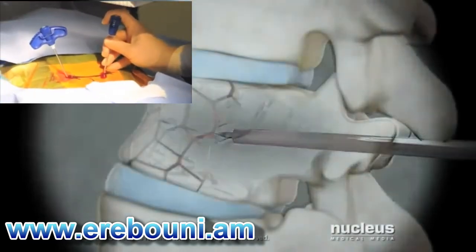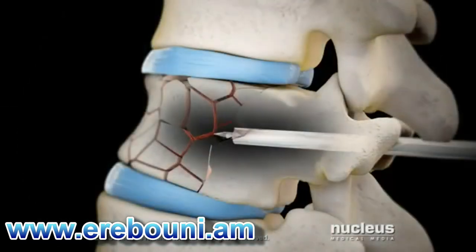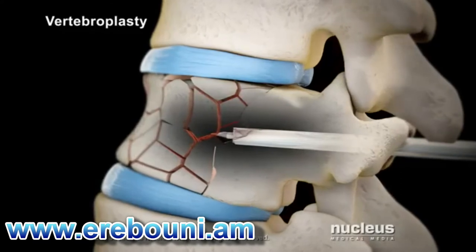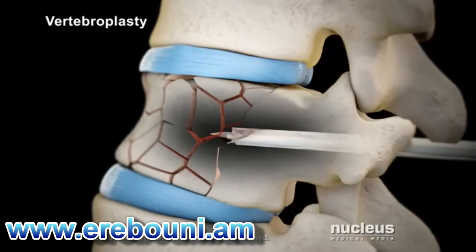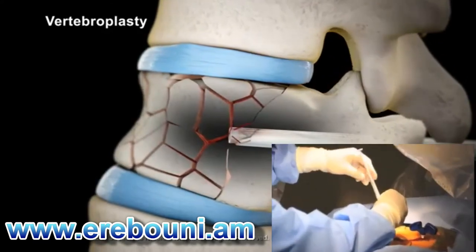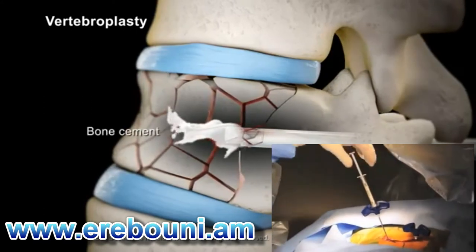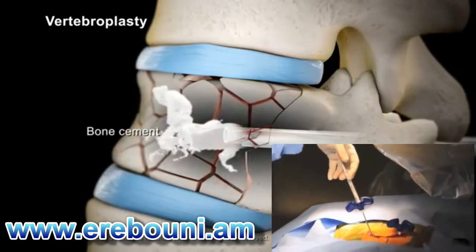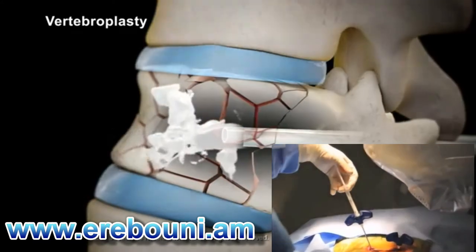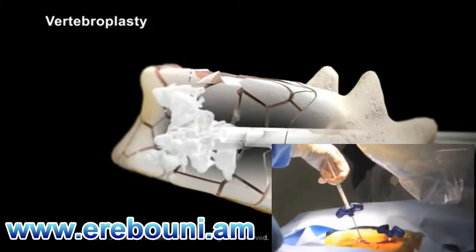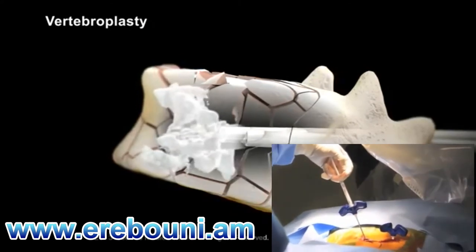If you are having a vertebroplasty procedure, your doctor will remove the trocar and then inject bone cement through each cannula to harden and stabilize your fractured vertebral body.